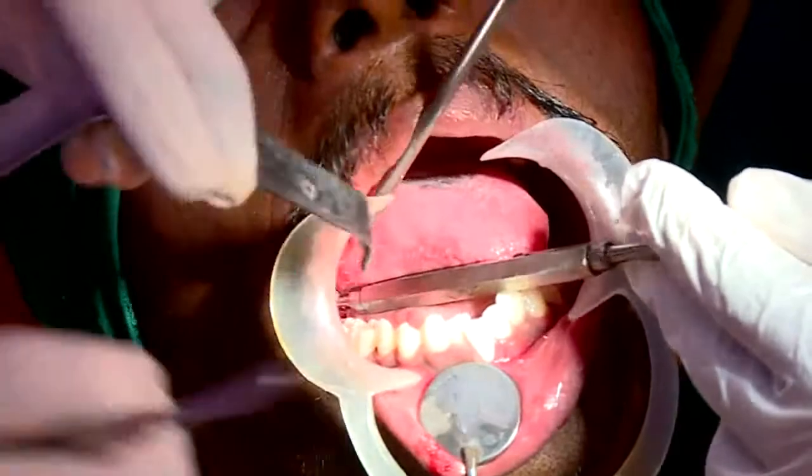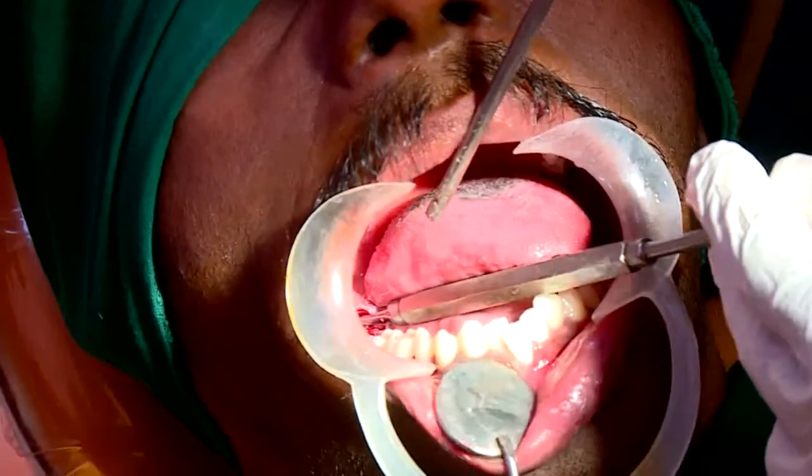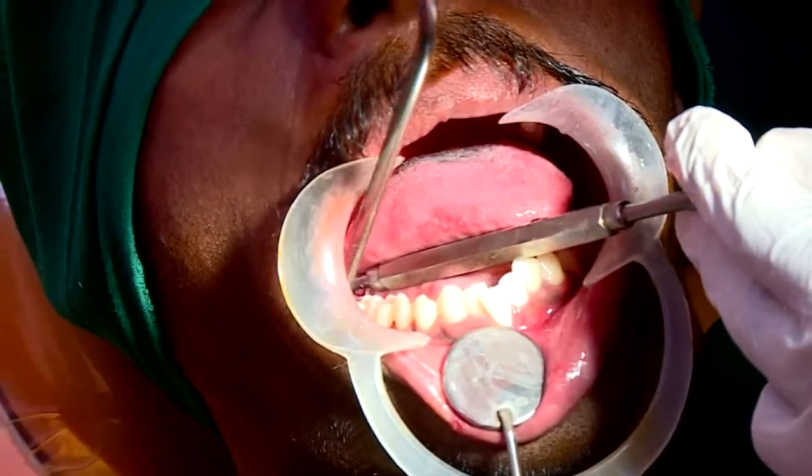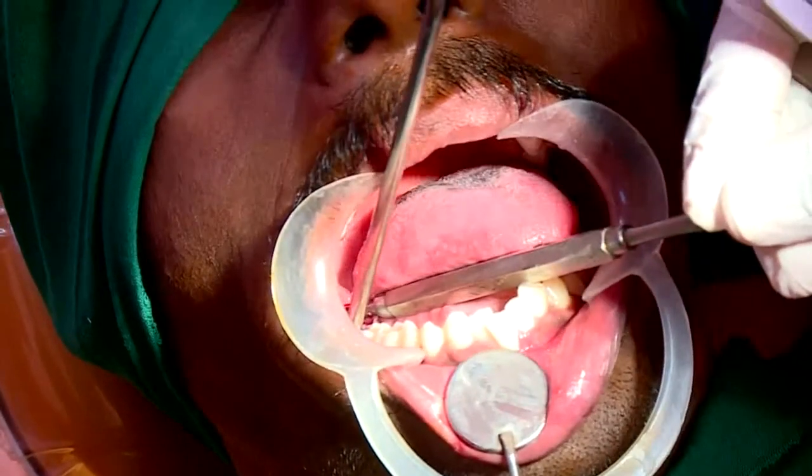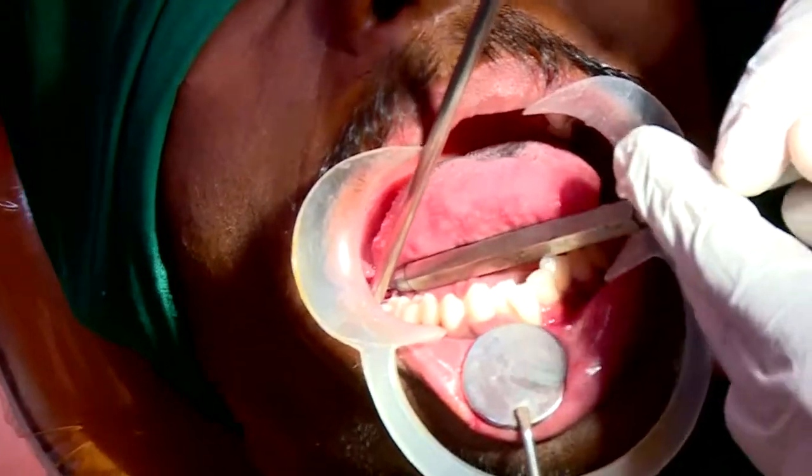When there is a tooth lock, you have to always split like this, either dividing it into a crown and root segment, or a crown, root, crown, root.